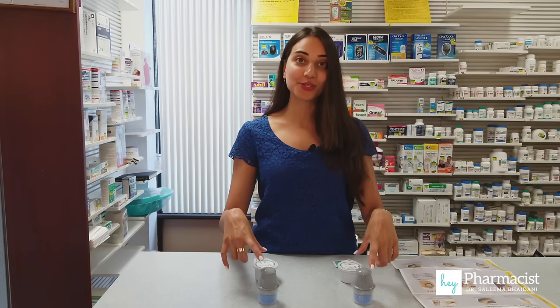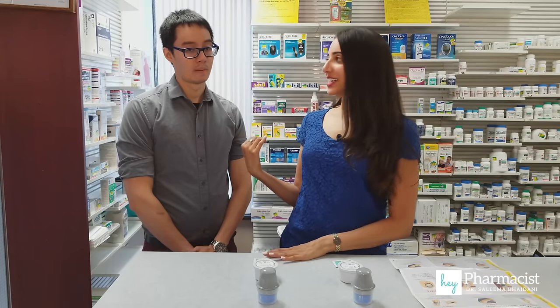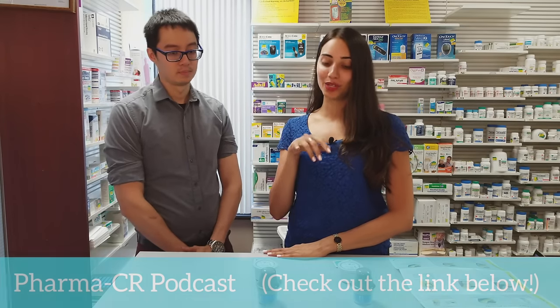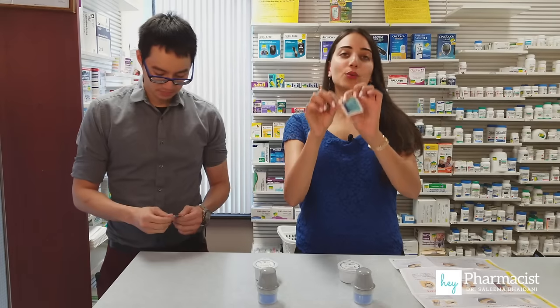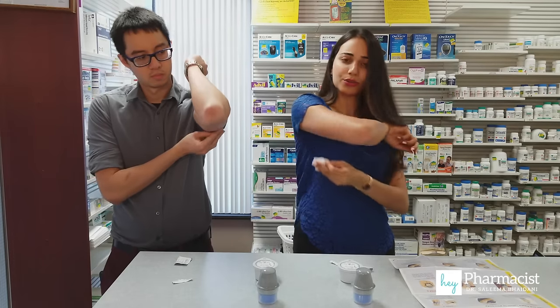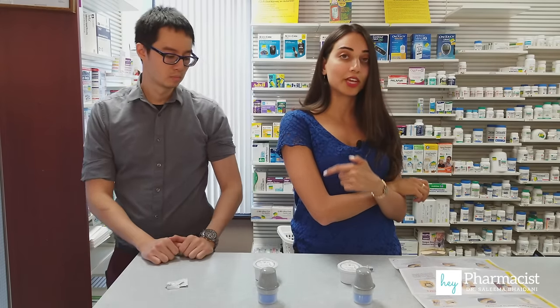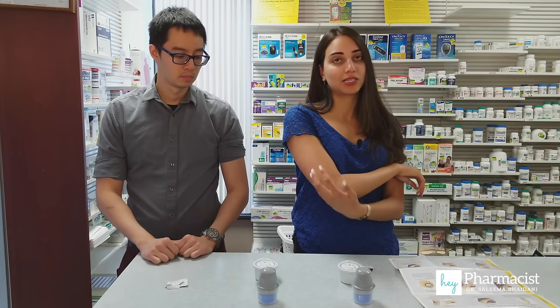Let's go ahead and do a demo. I've actually got two sensors here because I have a pharmacist friend and colleague Michael. He has a podcast called PharmaCR and him and his colleague Becky have done great work on a podcast related to this topic. So step one: we've chosen the arm we're going to use, and we're going to alcohol swab and clean the site. You should be using a flat site and this does have to dry before you put the sensor on. It's really important that the patient knows their skin shouldn't be oily, and if there's a lot of hair there make sure they shave it off — it'll just help the sensor stick better.